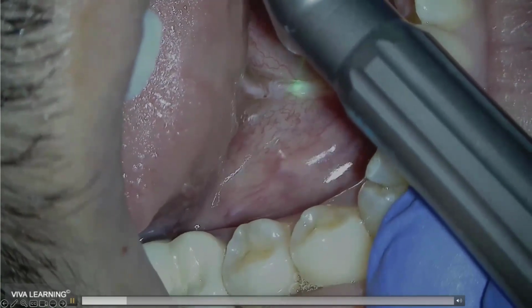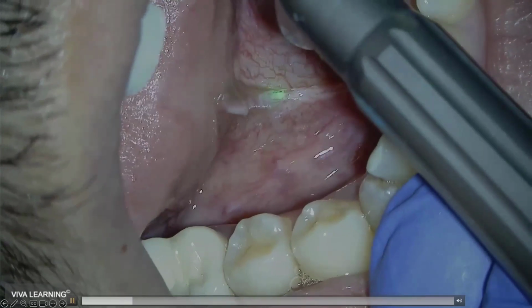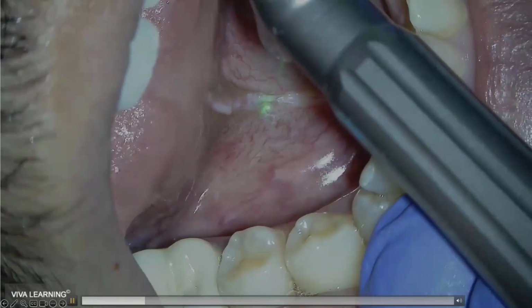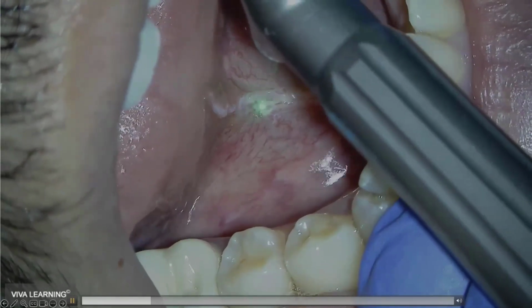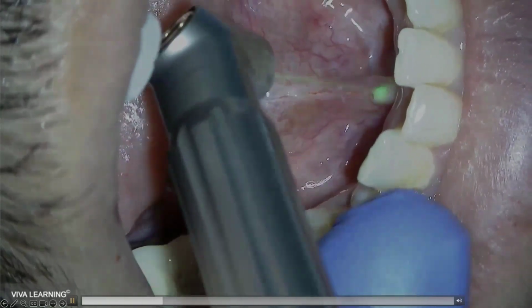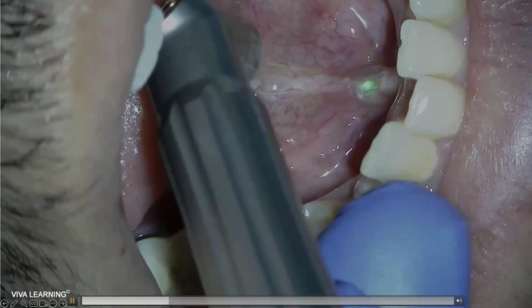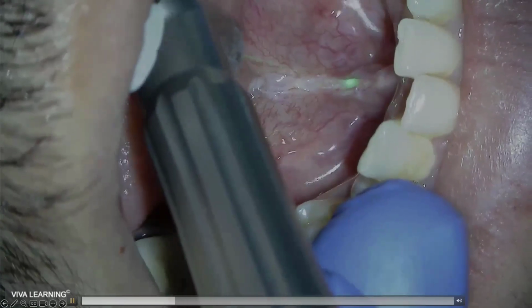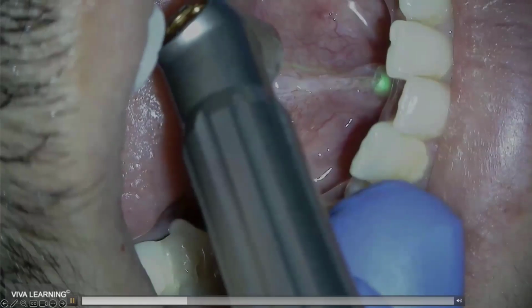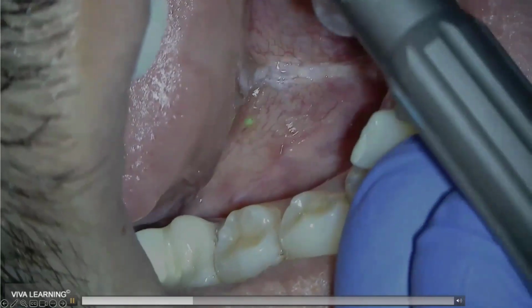I don't have to continue much farther than that. And we'll do a little revision on those extra tissue tags and smooth it out. So I can do everything from cut fast to, over here, I'm just going to hit those fibers and do a little sculpting to smooth that out and get the extra tissue taken care of.